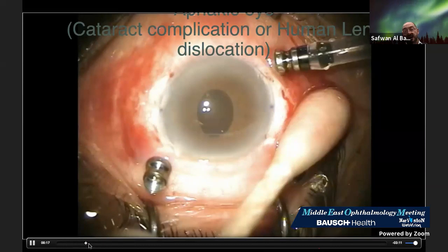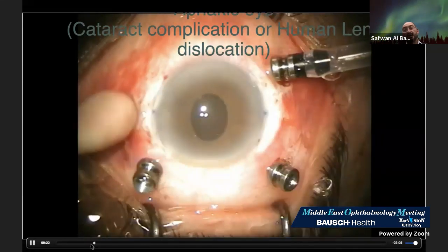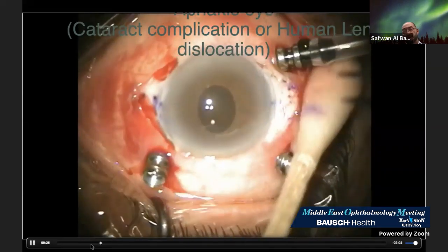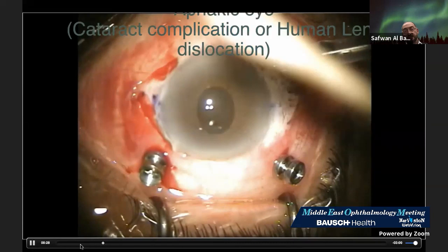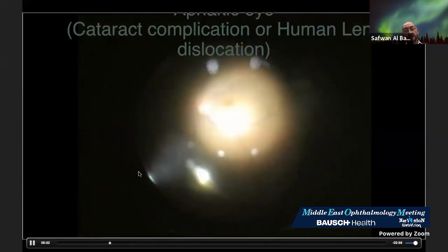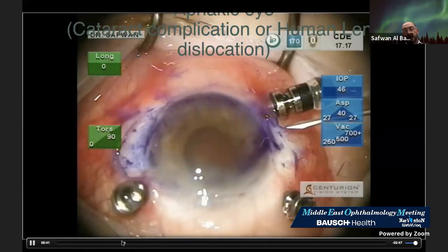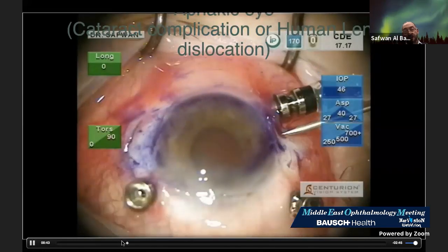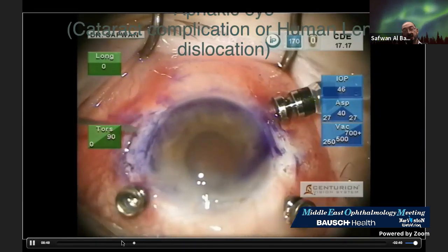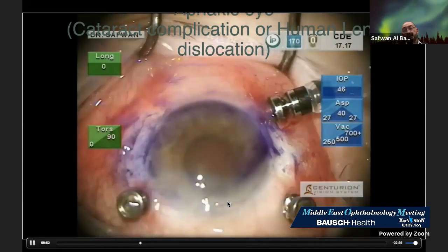The marker is very clear on 3 and 9. 2 millimeters from the limbus, 3 millimeters away from each sclerotomy here. Now, MVR through the sclerotomy to prepare it. I'm seeing the end of it for each. And then the main incision is open. It's 2.2.